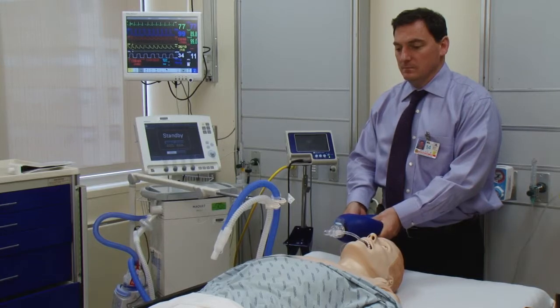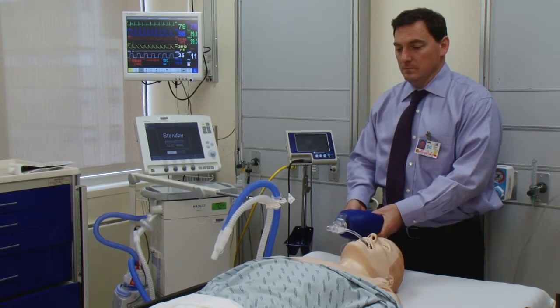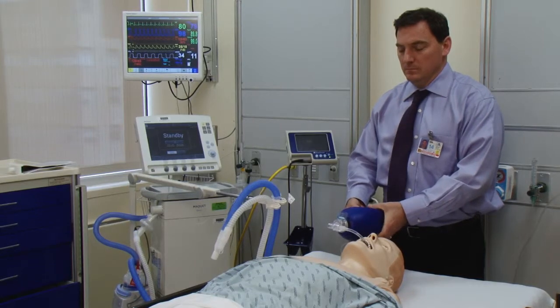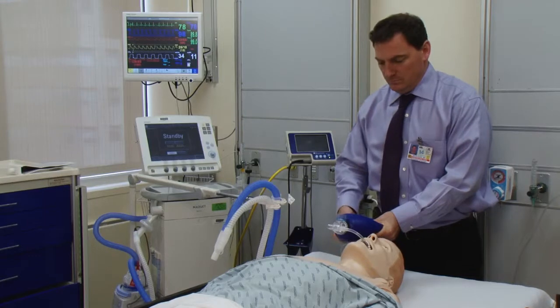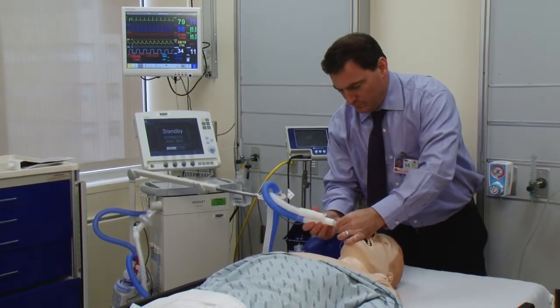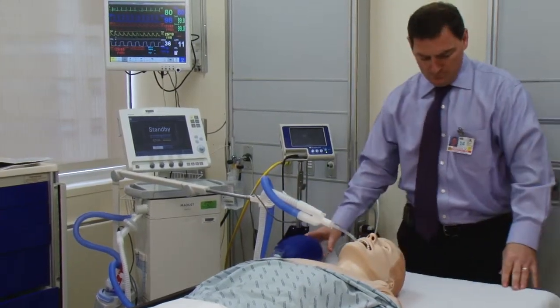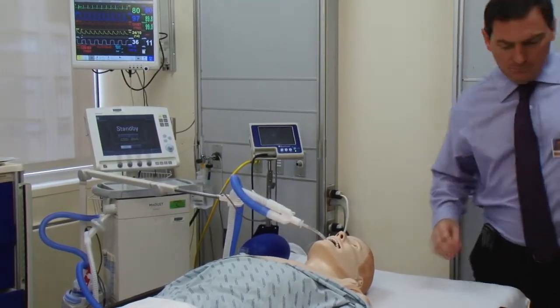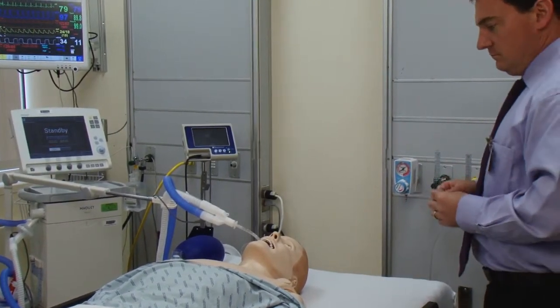Depending on the clinical setting, you may experience variable lung resistance and compliance when ventilating. If needed, SimMan 3G can be connected to the ventilator. The ventilators are preset to a tidal volume of 300 cc's and a PEEP of 0. Please do not change these settings, as they are in place to prevent damage to the lungs and extend the life of our simulators. Please verbalize to your instructors the settings that you would actually desire.